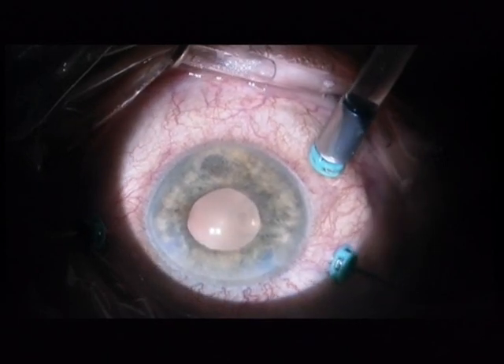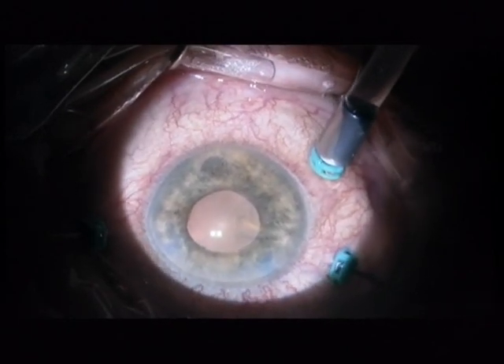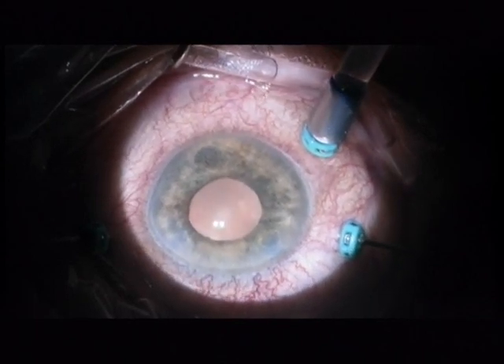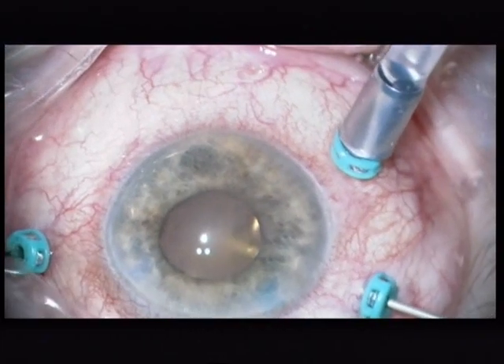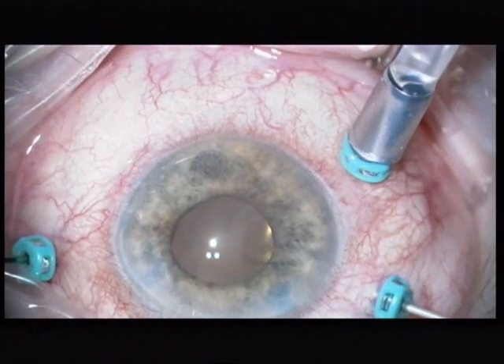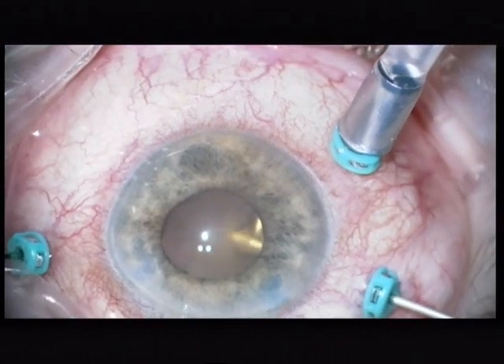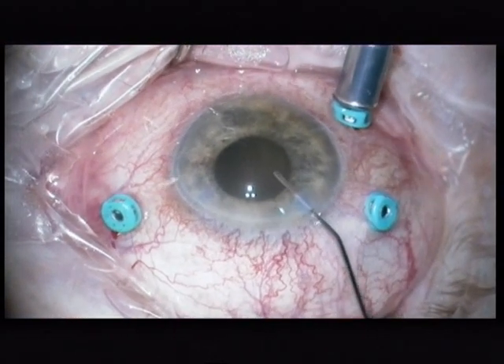So, what I am doing now — I am holding the cutter behind the lens capsule and doing a sort of a blind anterior vitrectomy. Now we are a bit further, you can see a bit better now, but that is a very, very bad view.